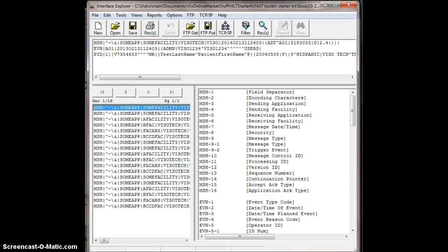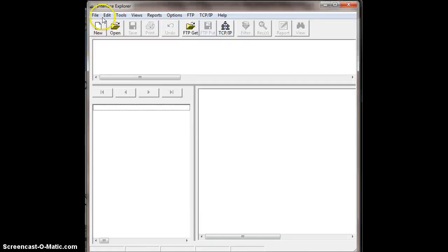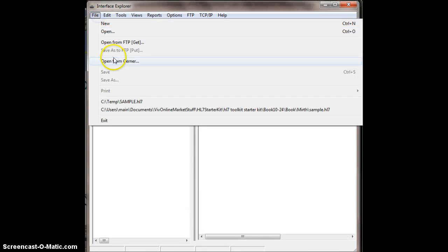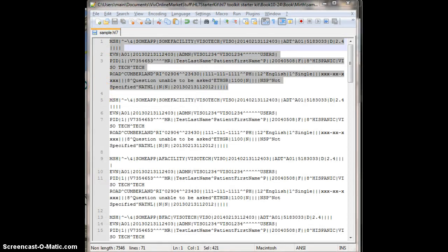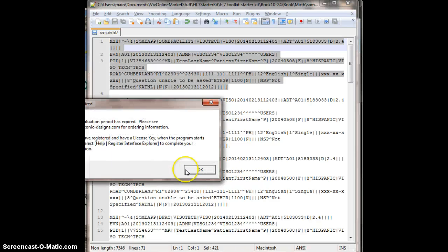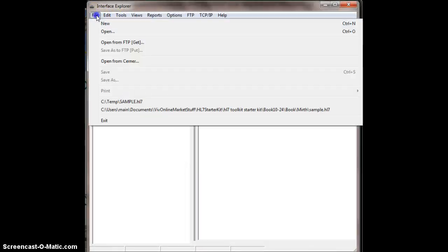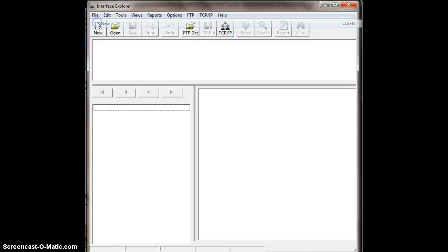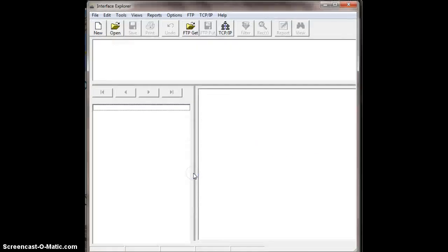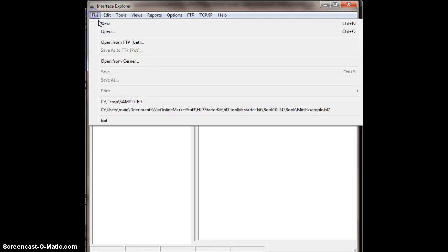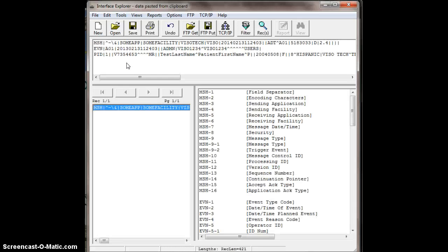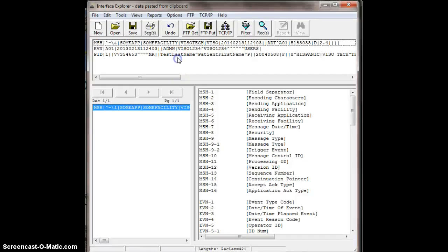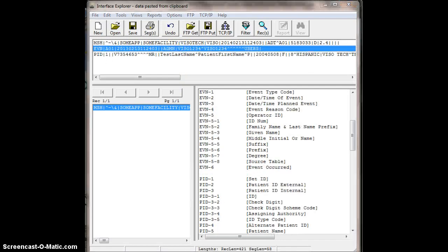So where are we, HL7 messages directly. You're going to want a new window. The button is disabled. If you're already inside Interface Explorer, you can create a new window by doing File New. If I click the button, Interface Explorer closes. Again, I think that's an issue with the application. Let's do File New. I'm going to click inside of here, and I'm going to CTRL-V and paste, and there we go. I can paste HL7 messages directly into here. That's another feature.